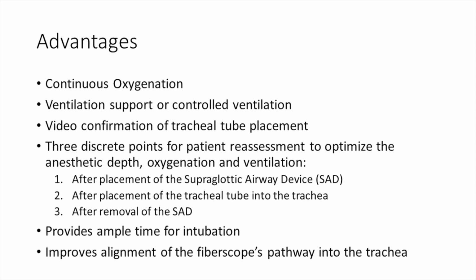This technique also provides ample time for intubation and improves the alignment of the fibroscope's pathway into the trachea, making it easier to use the fibroscope. Most of these advantages are predicated on the ability to have an effective airway via the supraglottic airway device. All providers must also realize that no technique is 100% successful. Thus, backup plans and appropriate personnel are essential in any airway management plan.